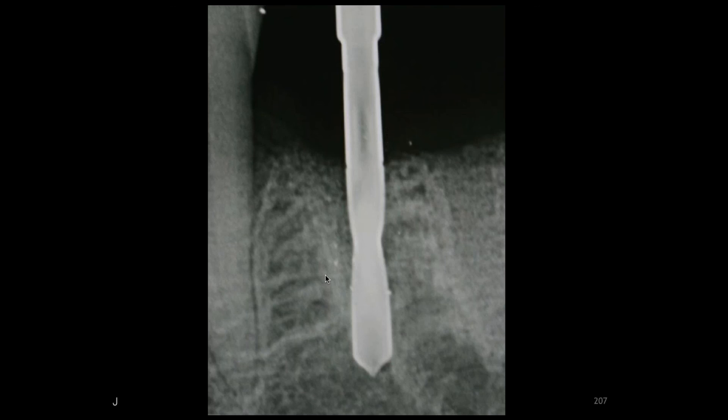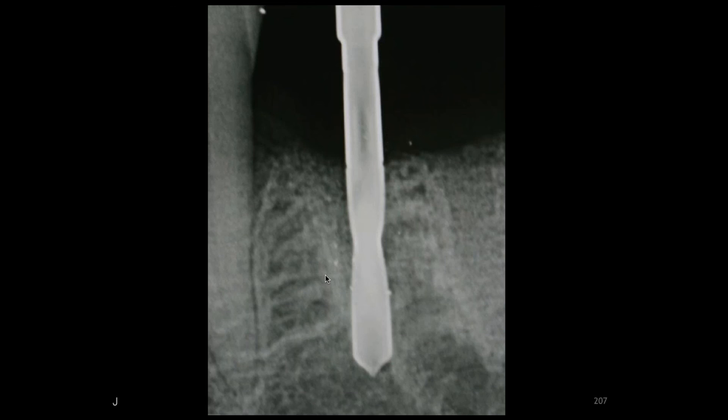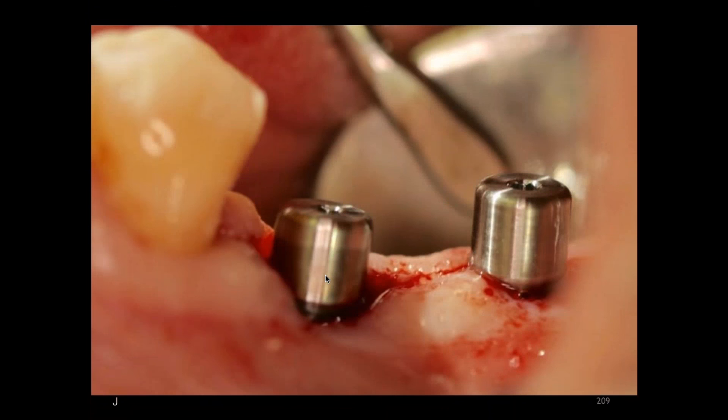We see the two positions for the two implants, with optimum spacing so that the crowns are going to look like teeth. The implants have been placed using a flap technique — indications for that approach include ridges that are wide enough, adequate keratinized tissue, and no surprises or severe undercuts. We can see the implants are lined up in good position relative to the opposing dentition.